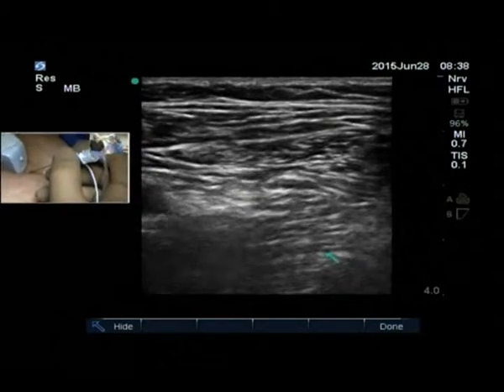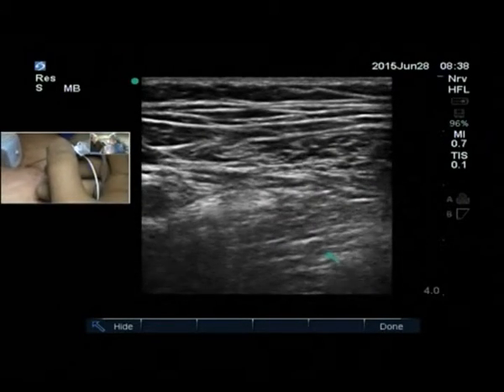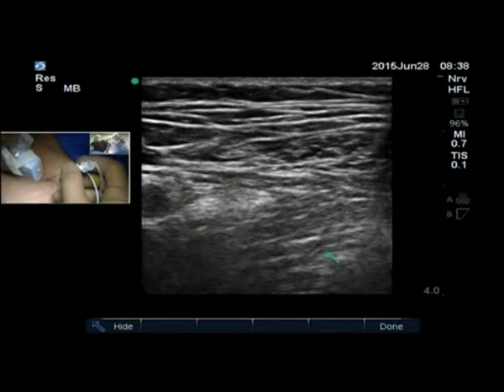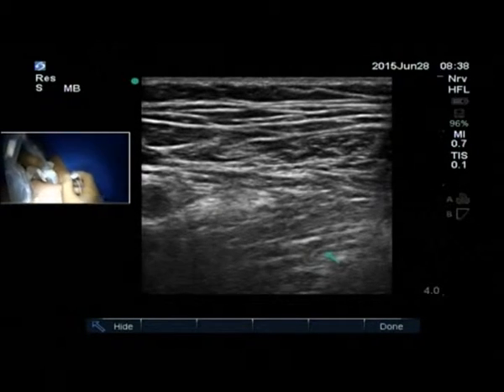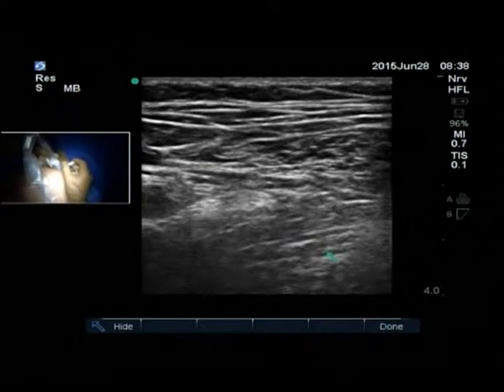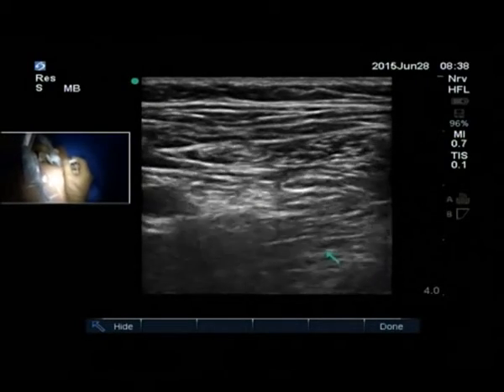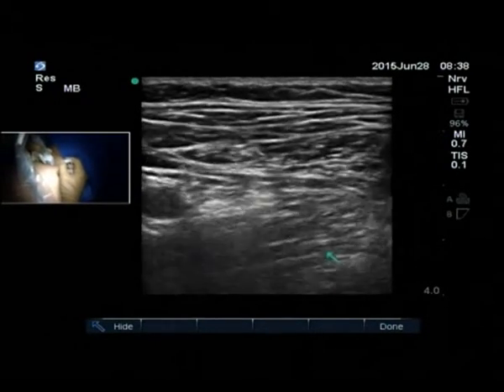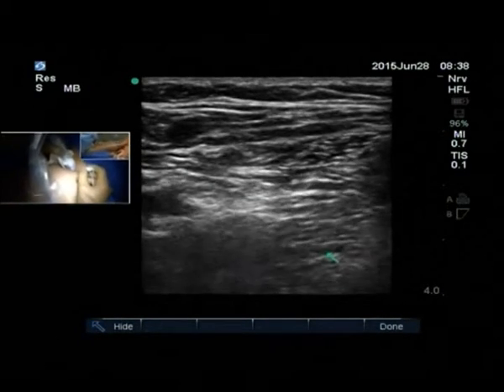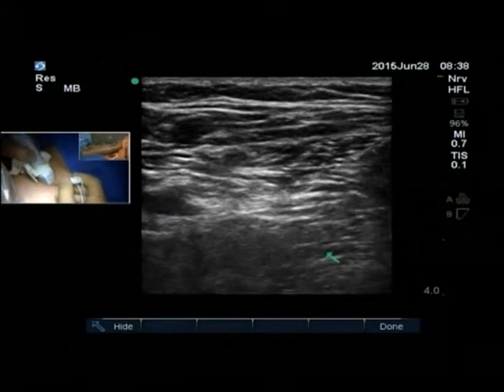Okay, so you should look at the... So it's a dual block. The peripheral nerve stimulator is being used. It's not stimulating right now, so you don't see any twitch. You would see the quadriceps contractions. So right now the stimulator is not working. We are trying to fix it. But you can see that I'm there. I'm jiggling. For this block, again, all I want is the local anesthetic to spread in this compartment.